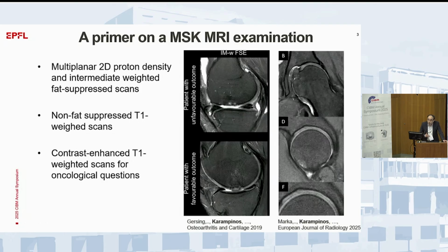On the other hand, you have to do that in multiple planes, and this is a very interesting topic where 3D imaging in musculoskeletal MRI has not really made it all the way, although it is being increasingly adopted at different sites. You have to scan anatomies that vary very rapidly in three dimensions, and here is an example of the hip. This is looking at the articular cartilage surrounding the hip. You can imagine the femur is like a sphere, so you have huge problems with partial voluming, and many times you perform the imaging in different planes.